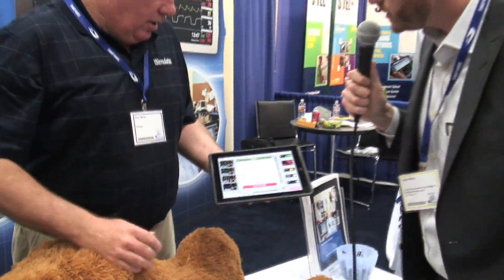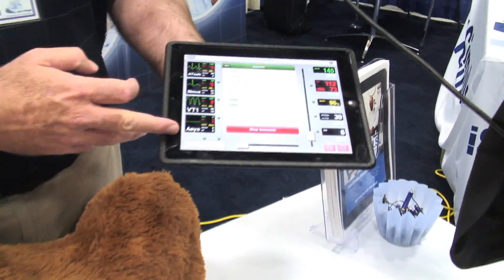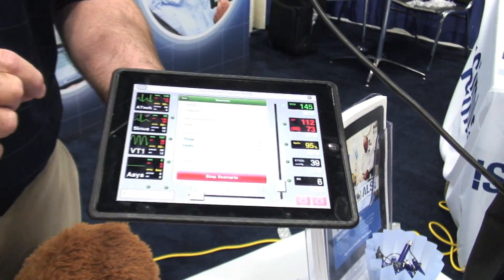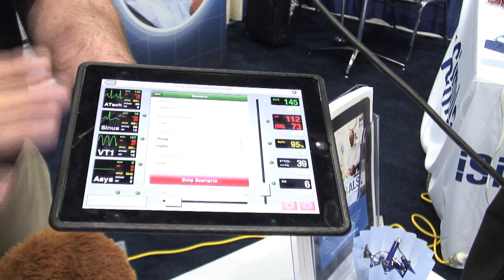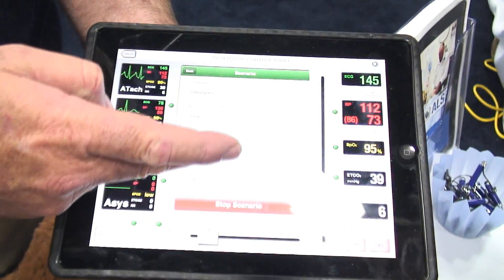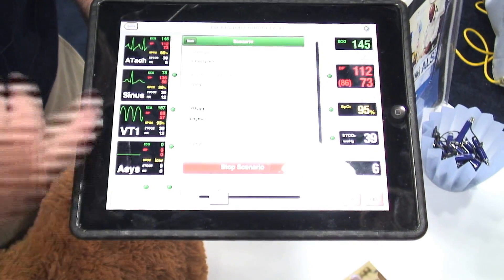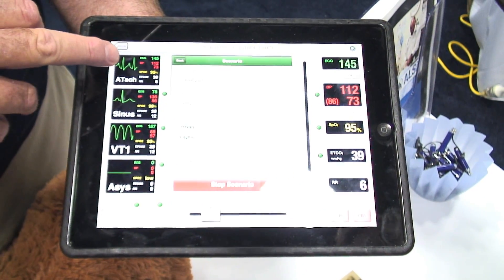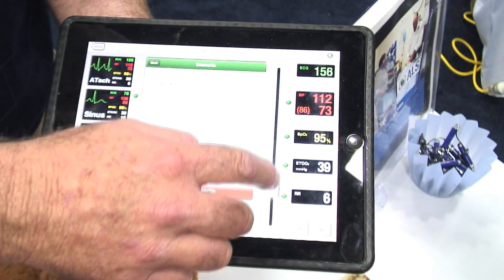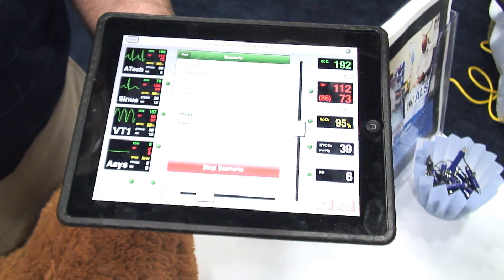Tell me a little bit about this control unit here. What we're seeing here is we've got four ECGs. Each one can be individually adapted to give you a flow that runs in a scenario, and as the student does certain things you can tick it. You can also change it on the fly — at the moment we're sitting in an atrial tachycardia at 145, but very quickly we can increase it and we'll get the result on the monitor, so you get that instantaneous feedback.